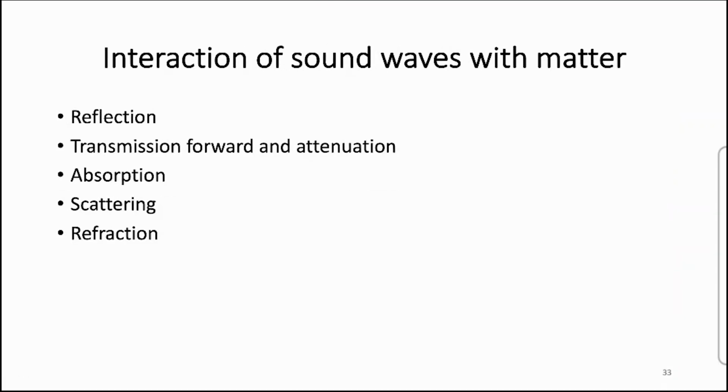Now, a few things we have to keep in mind. What do the sound waves do when they interact with the human body? There are certain things like reflection, transmission forward, attenuation, absorption, scattering, and refraction. Very important are two or three things: the reflection and the attenuation.